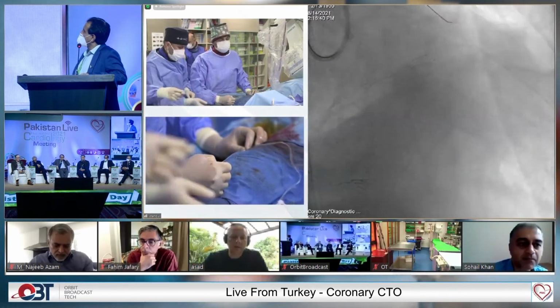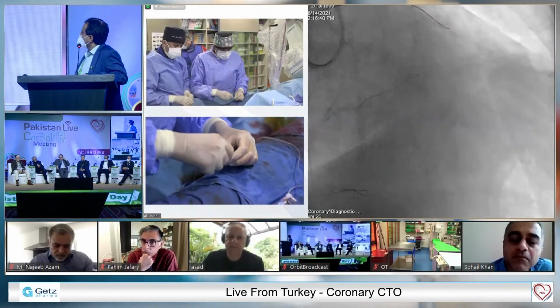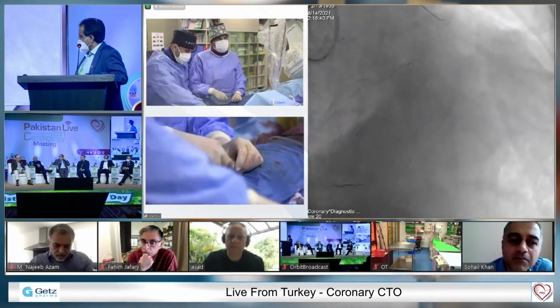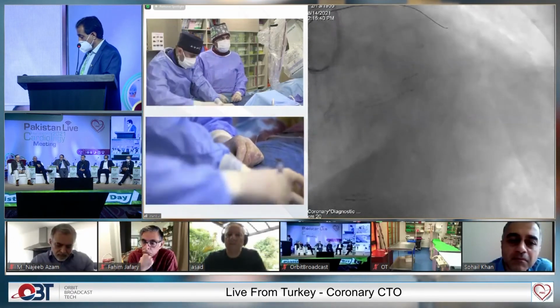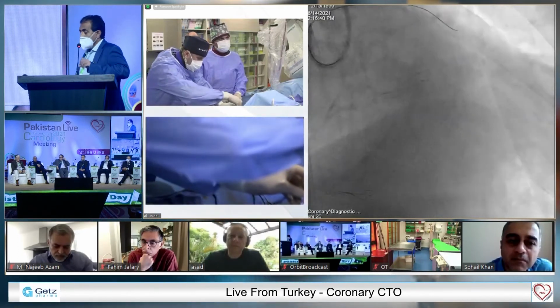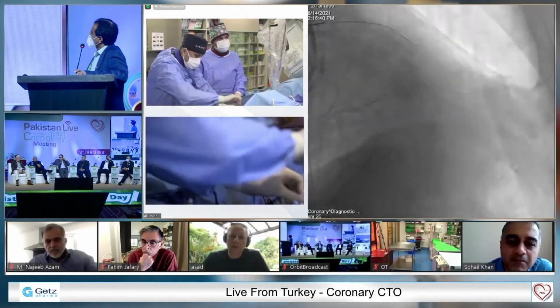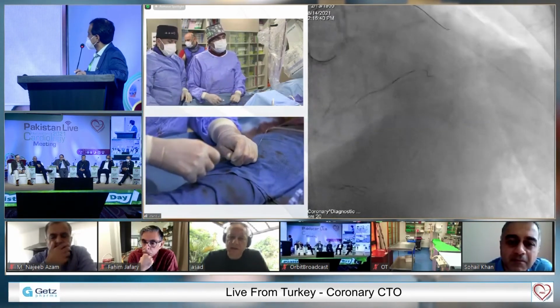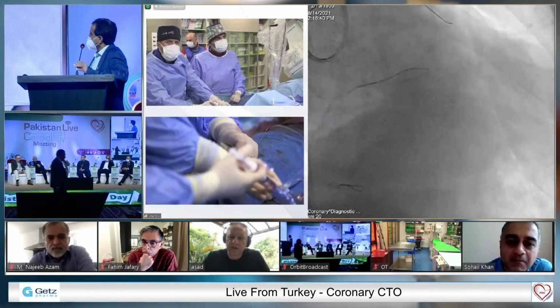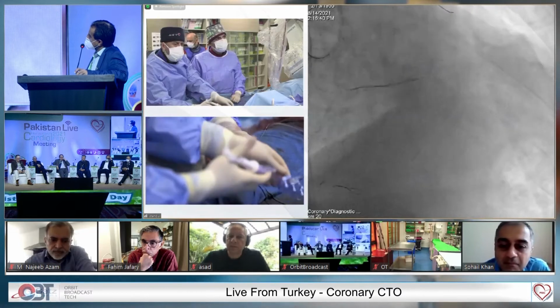Better now? Yes. So, Omar, it's our mistake, to be honest. With the tip injection, I don't see them, but I trust the other view. But I trust the tip injection. What do you think? Do you feel the same? Yes, I think it's a nice example of changing views, and also of trusting the injection.